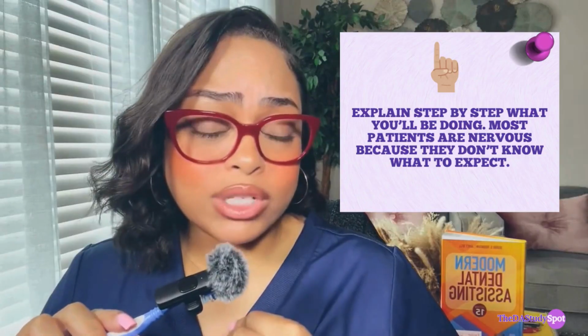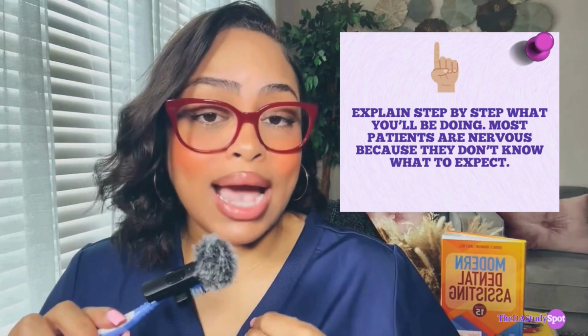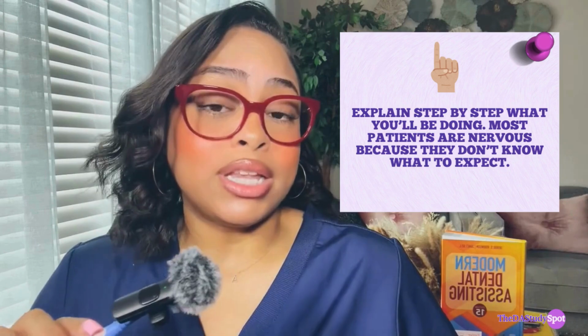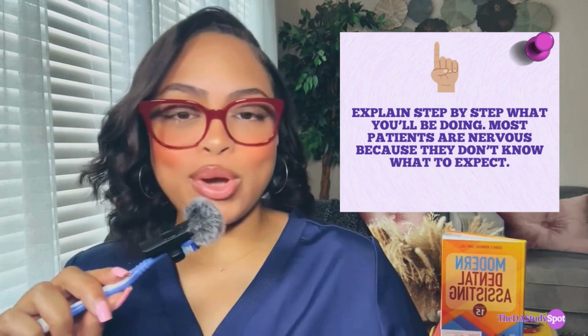Another thing that I always found helpful for patients with dental anxiety is explaining to them what I, the dental assistant, will be doing. Hi, my name is Leela. I'm going to be taking a series of images of your teeth today. Some of them are going to be a little bit uncomfortable, but I'm going to do my best to get it done as soon as possible. I get right to the point and ask if they have a gag reflex. If they say yes, then you let them know you're going to start with the front teeth, which is most comfortable. Now let's do a quick review.